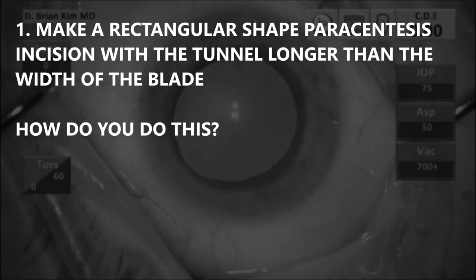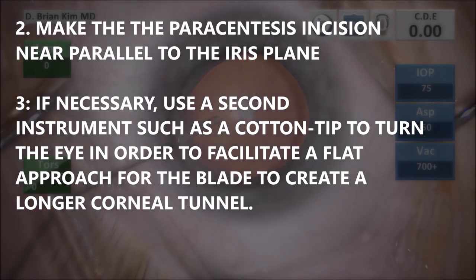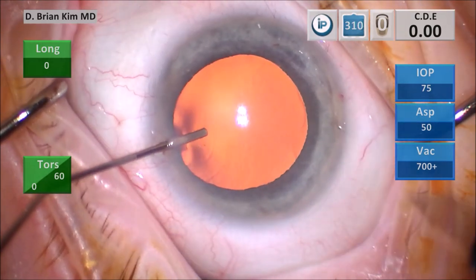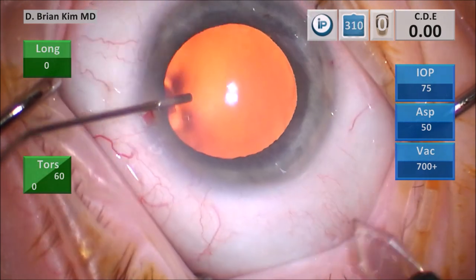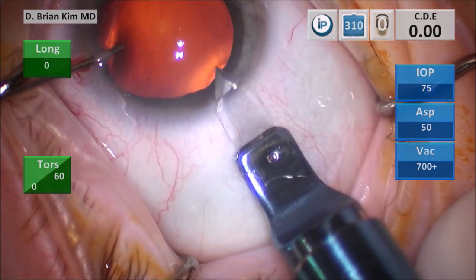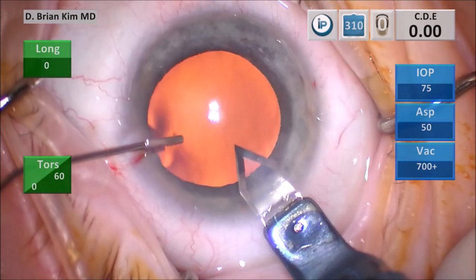Rule number one: make a rectangular-shaped paracentesis incision with a tunnel longer than the width of the blade. You want to make the paracentesis incision near parallel to the iris plane. If necessary, use a second instrument such as a cotton tip to turn the eye in order to facilitate a flat approach for the blade to create a longer corneal tunnel. After filling the anterior chamber with viscoelastic, turn the eye using the cannula, then place the blade in a vertical position. Make your groove, then place the blade within the groove and tunnel through the cornea to the desired length, then go heel up and stab into the eye to create your corneal incision.